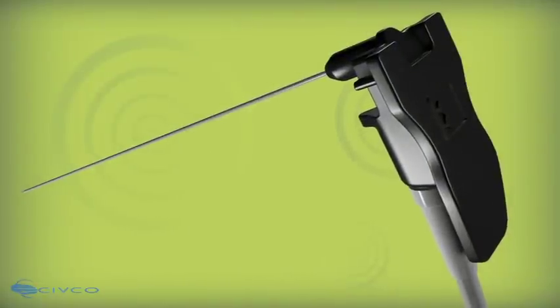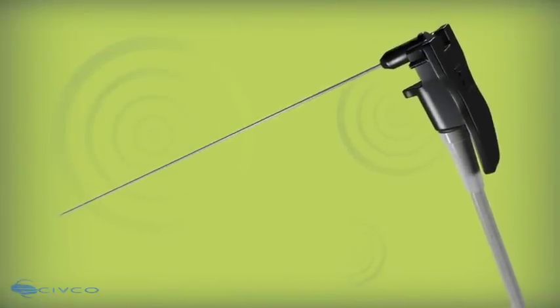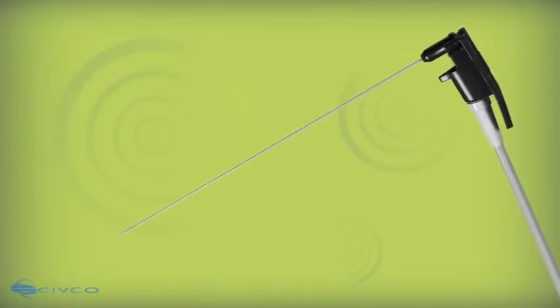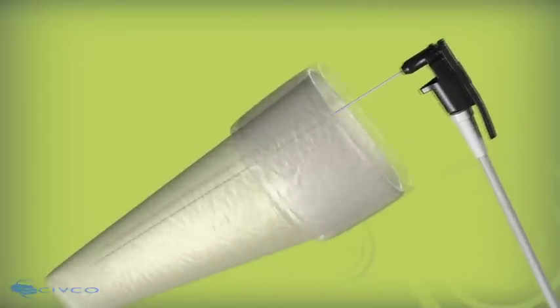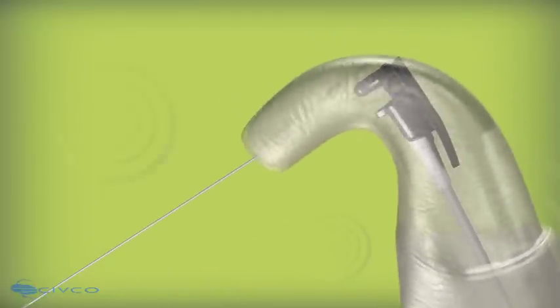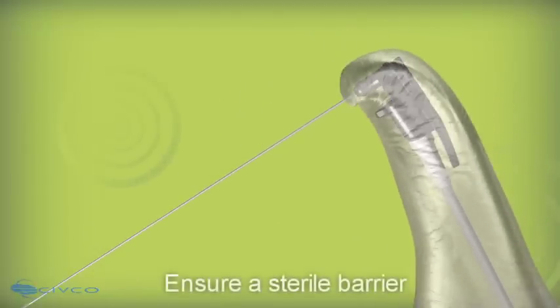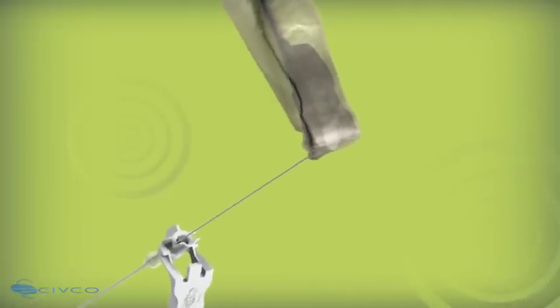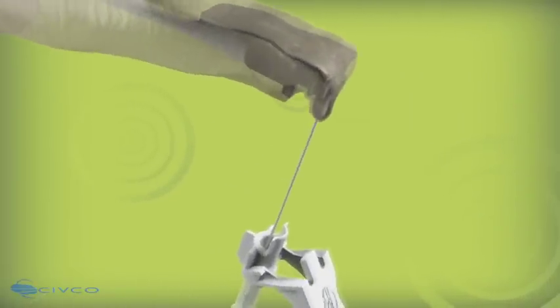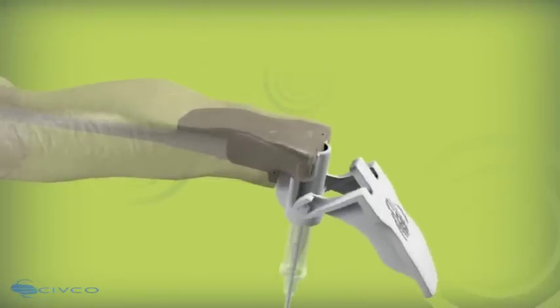Civco's proprietary E-Trax needle guidance system features a protective disposable cover to ensure sterility. Using sterile technique to assemble the E-Trax needle system, cover the non-sterile E-Trax needle sensor with a CivFlex sensor cover to ensure a sterile barrier. Then slide the sterile disposable needle sheath over the E-Trax needle sensor assembly and snap into place with a single click.